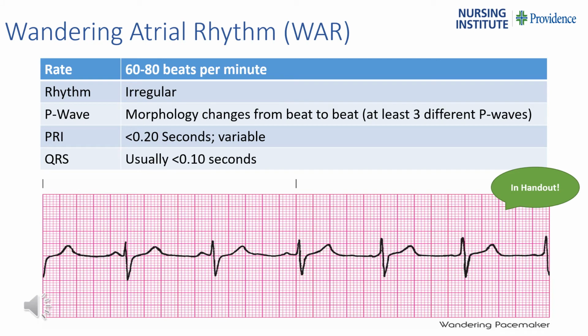Let's talk about wandering atrial rhythm, or WAR. Please get out your handout and pause the video if you need to take a minute to review this slide in a little more detail.